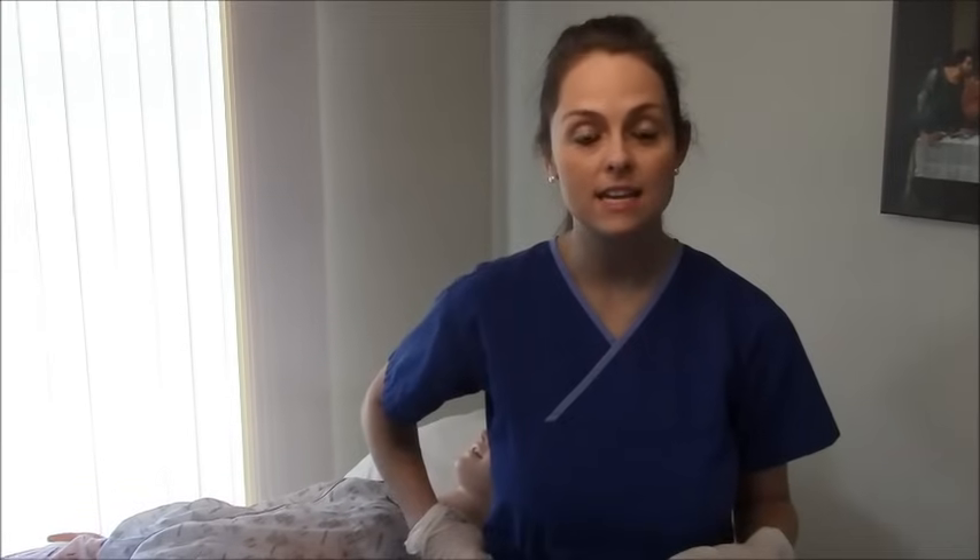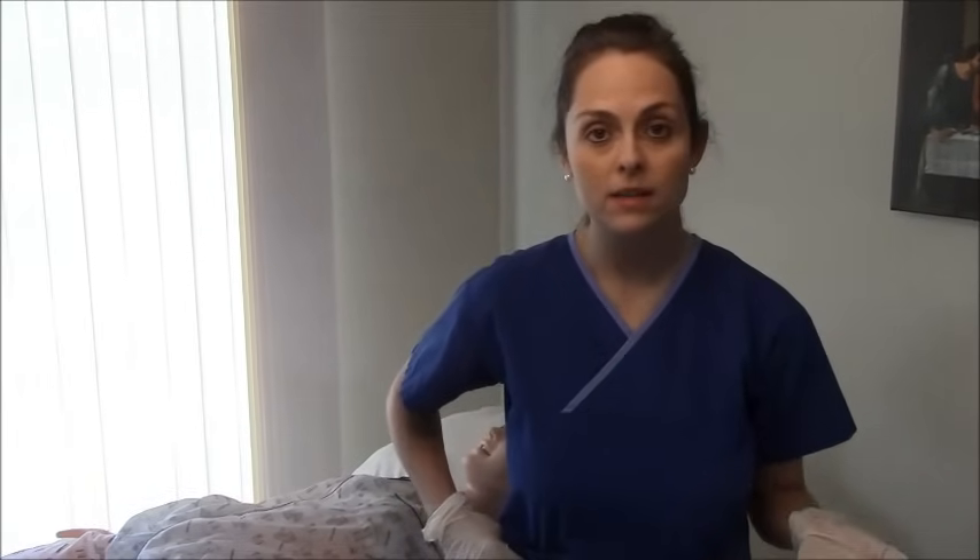Hey, this is Sarah with RegisterNurseRN.com and today I'm going to show you how to give a sub-Q injection. A sub-Q injection, also known as a subcutaneous injection, is an injection that goes into the fat of the skin. It's different than an intramuscular shot, which is given in a muscle. So I'm going to show you how that's done.